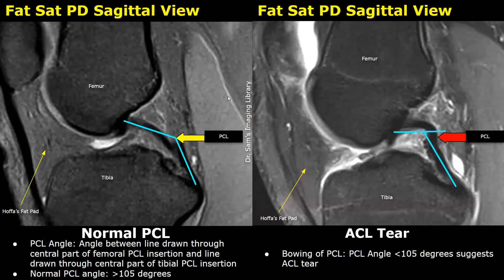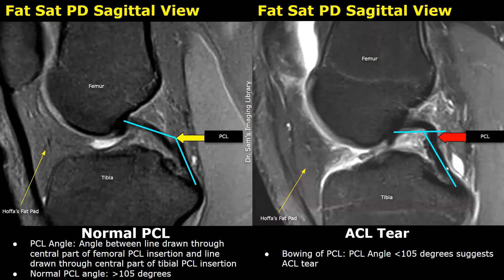A PCL angle is also used. It is the angle between the line drawn through the central part of the femoral PCL insertion and the line drawn through the central part of the tibial PCL insertion. This angle is usually more than 105 degrees in normal cases. When there is an ACL tear, the PCL angle can change and will be less than 105 degrees, suggesting an ACL tear.